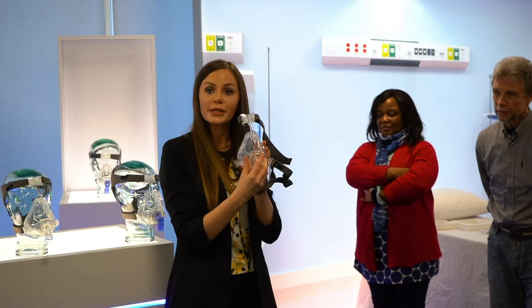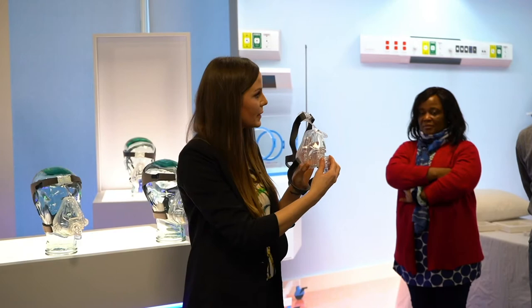If the circuit pulls it and there's no flexibility there, you're going to get a very, very bad pressure sore, a very, very bad pressure ulcer. And these pressure sores cost the NHS quite a lot to treat, anything between £1,000 to £15,000, depending on the grade of the pressure ulcer. And they grade them from 1 to 4, okay? And 4% of the NHS expenditure is spent treating pressure sores and pressure ulcers, okay?